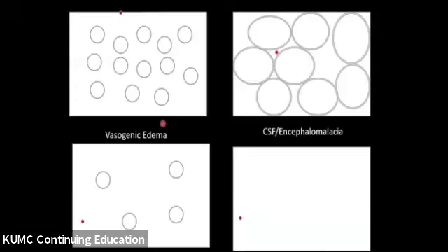Eventually, the cells are going to lyse, they're going to break down, and the fluid will leak outside of the cells into what is called extracellular edema or vasogenic type edema. And in that environment, the protons will move even better in most cases than normal brain because it's a high fluid state. The protons move very well, so there's more motion. Time goes on even further. If it's a big infarct, it's going to liquefy entirely, undergo encephalomalacia, or basically be a simple fluid state like CSF. And in that environment, the protons move the best. They're going to be in a simple fluid, with great movement.